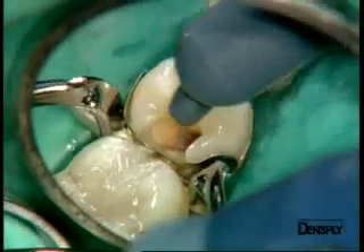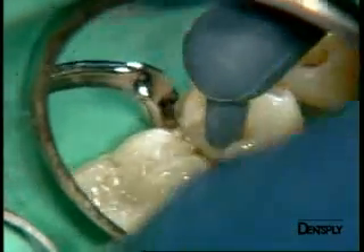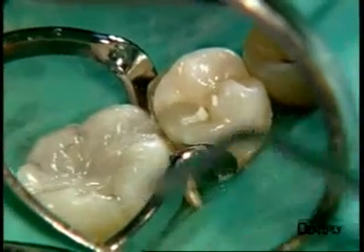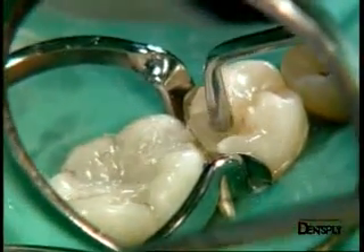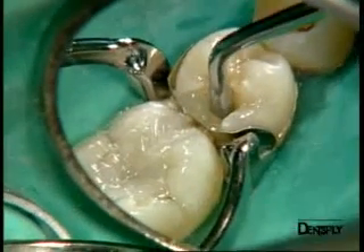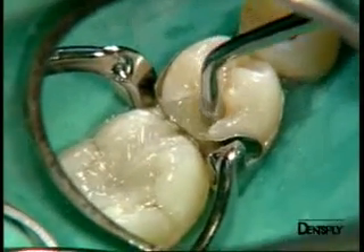We place at once a large amount of Quicksville. The condenser makes this bulk filling smooth, and you can see how we can easily form the distal marginal crest without ever touching it. This was done by modeling the homogeneous mass of composite material.